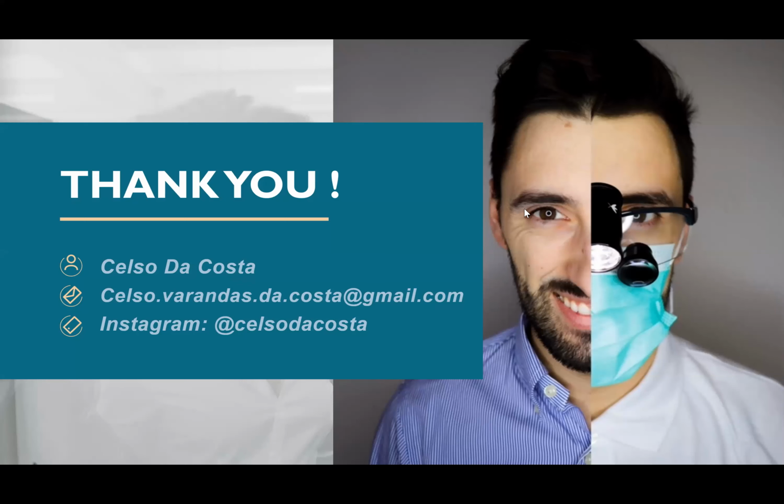Okay, this is one of the things. You need to keep the lamp 5 centimeters in distance from the mouth of the patient. Don't glue the lamp to the teeth of the patient. You need the air to circulate around it. I use 3 fingers because it's more or less 5 centimeters of distance to put the lamp at the right distance. Till now, I don't have any complaints, just one who said, okay, it's heating a little bit, but it's just for the first 2 minutes. Honestly, I always say, okay, in the first minute you can feel that it is heating, it's just the product getting the chemical reactions, but then you don't feel anything else. Some of them at the end say, well, I didn't feel anything. You are a liar, you don't feel anything. Others say, yeah, you were right at the beginning, I felt something, but then it was okay.